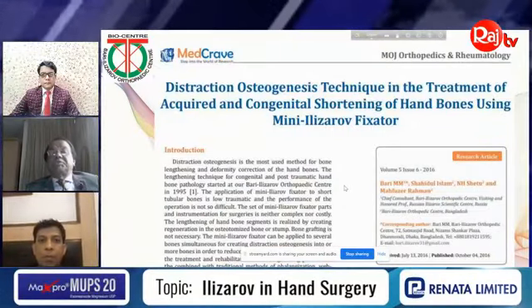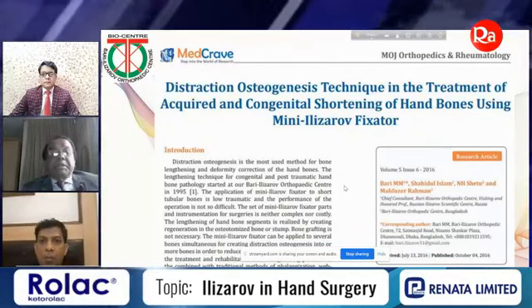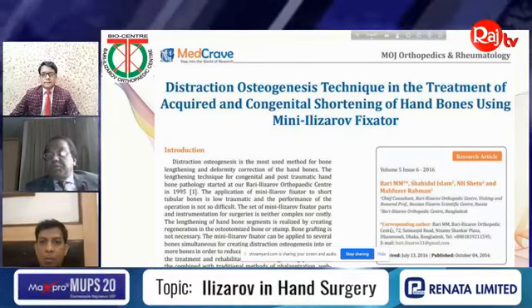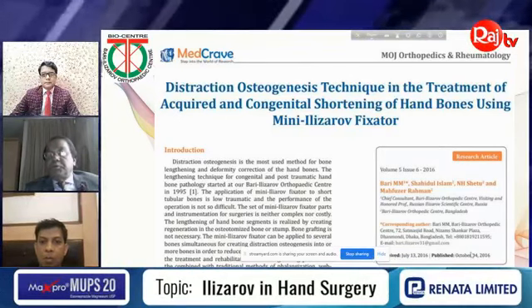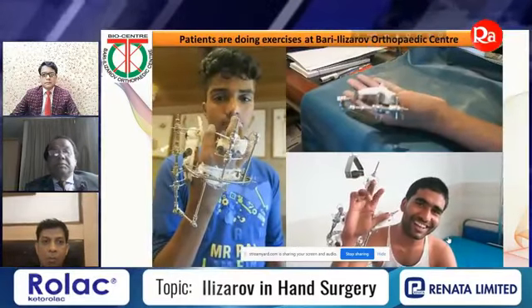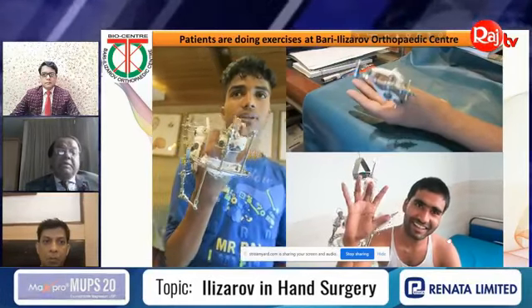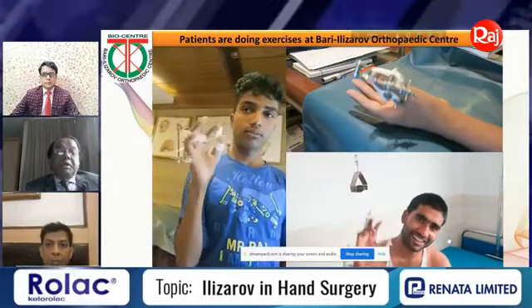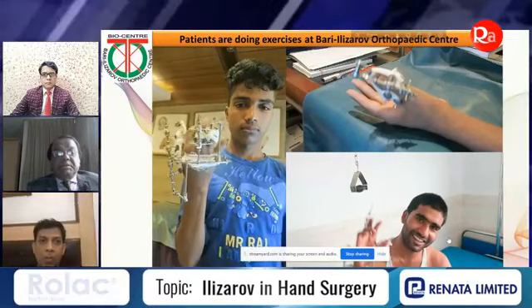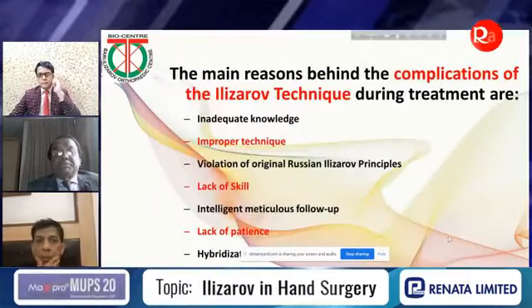This is also published in MedCrave in 2016. See, I have done the cases. And you can see here 2016, 4th October. This is the publication in MedCrave journal. You see, whenever you are putting Ilizarov in the hand, the patient can do any kind of exercises, and the healing process will be very good when you advise your patient with the fixator to go for exercises.